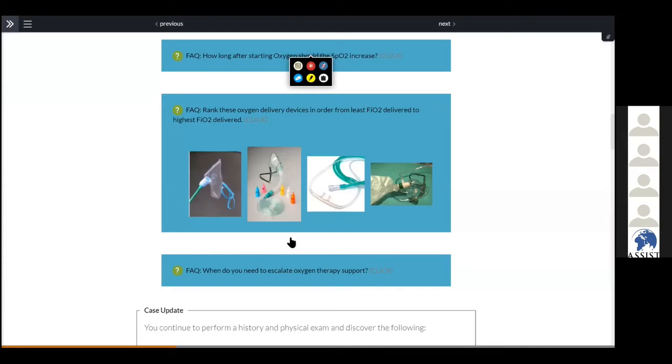Thank you very much. Any question? If there are questions, we can put the questions in the chat. And yeah, this is very, very important. Our participants could understand what device to choose. When a patient comes to your office at emergency and you put on a pulse oximeter, and you realize that the patient is hypoxic, you have different oxygen devices: nasal cannula, simple facial mask, and facial mask with reservoir. Which one do you choose to put on the patient? In which situation, in which circumstance? This is very, very important. Thank you very much, Jean-Paul.